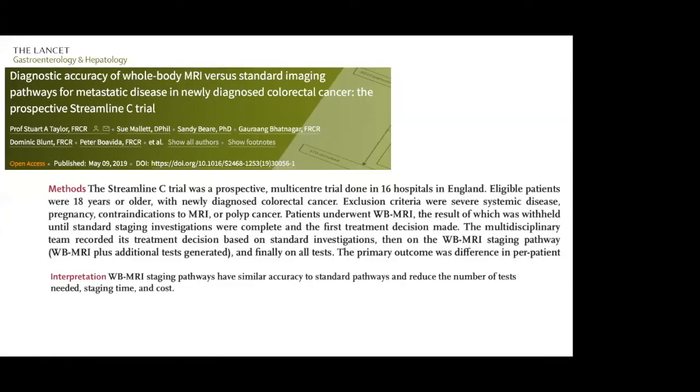And the only thing I just want to mention before concluding is this study here, which was done in the UK, at UCL by the group led by Stuart Taylor. They looked at the diagnostic accuracy of whole body MRI as a first line test in newly diagnosed colorectal cancer, to see if the pathway for detecting metastatic cancer was equal to the standard pathways. And what they found was that they had similar accuracy. They reduced the number of tests and the staging time. The staging time is about 8 days when they only did whole body MRI, and standard would be 13 days, and the cost was also lower.